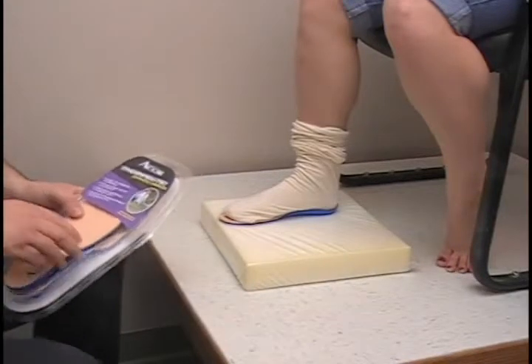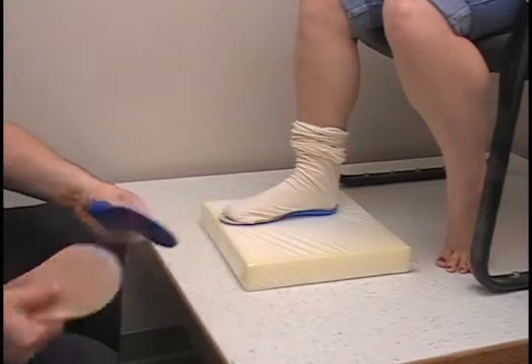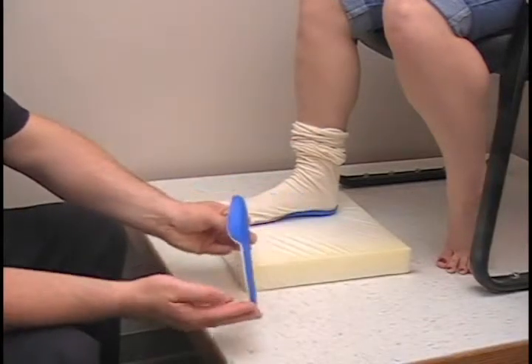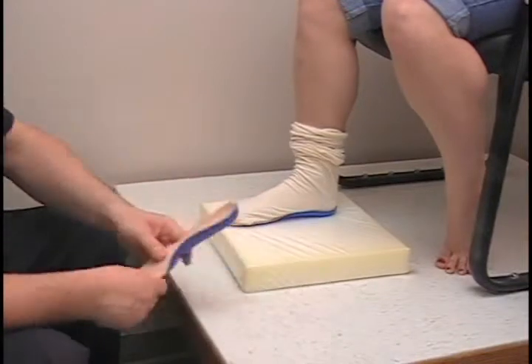This one happens to be a new product from ACOR — it's pretty unique. It has the thermal mold on the bottom, very similar to that, but it has the pour-on in the center. And we're going to heat that up the same way.